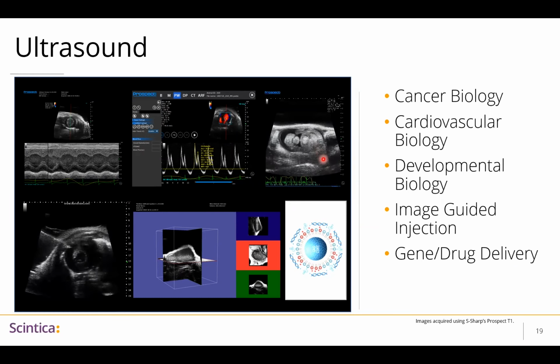If for some reason there was something that was lethal to this embryo, whether it's transgenic or exposure to a specific toxin, we could identify when the animal or the embryo is no longer viable. And we could look at perhaps why. Does the heart not develop properly? Does the brain not develop properly?